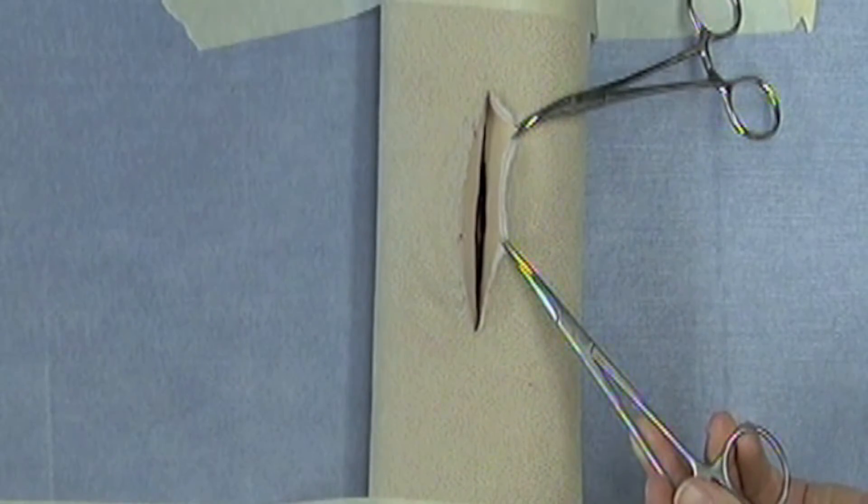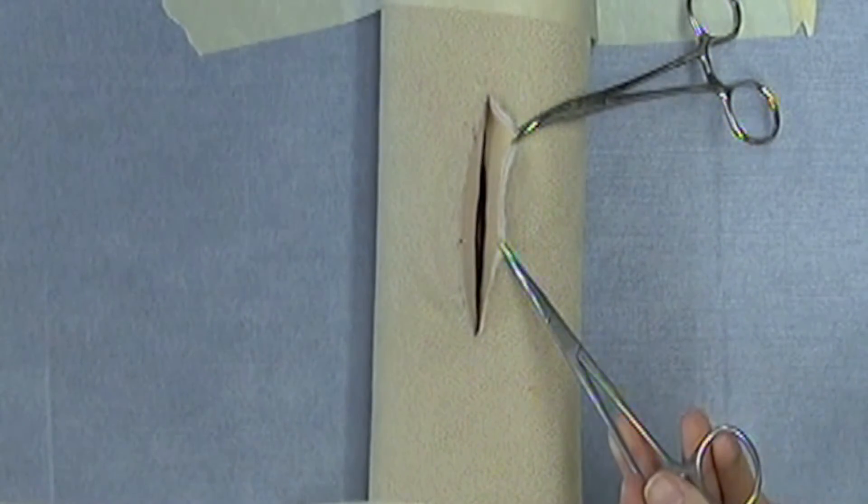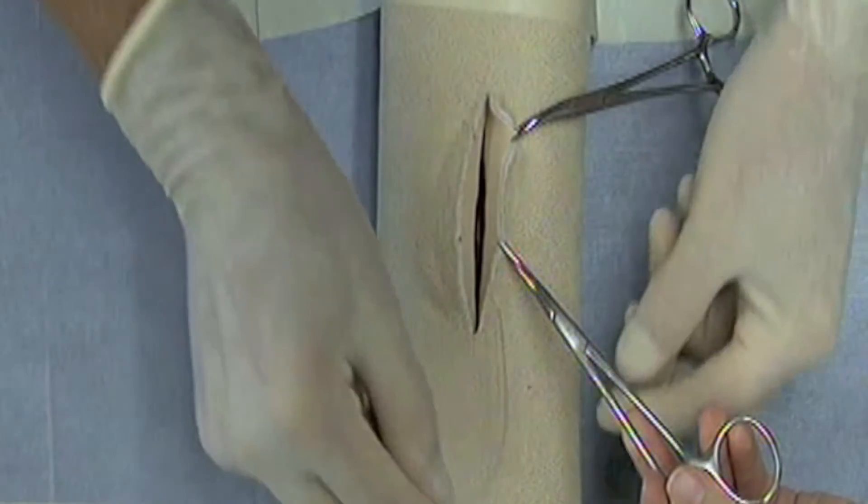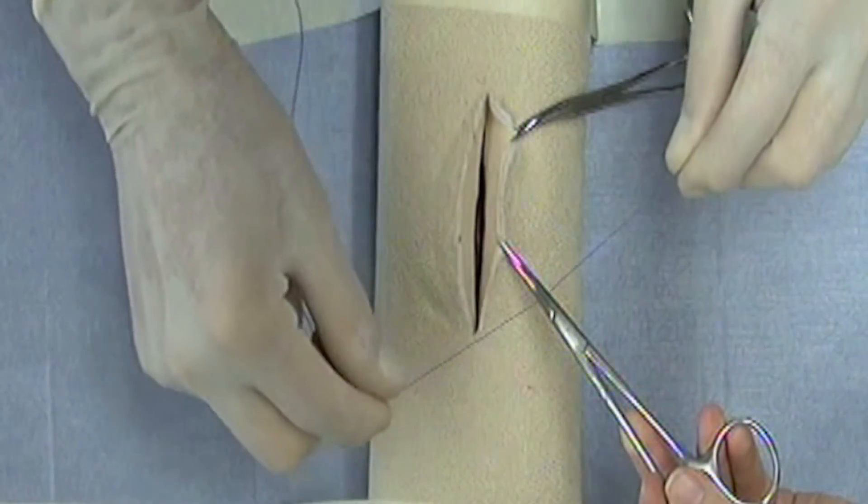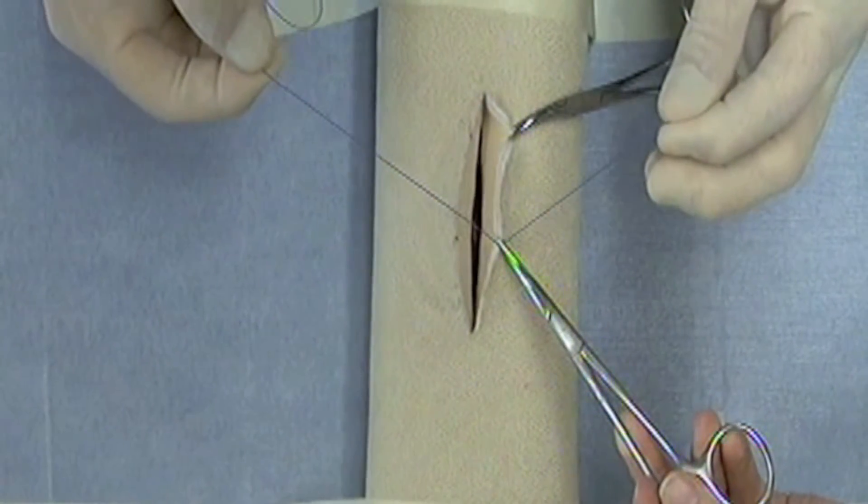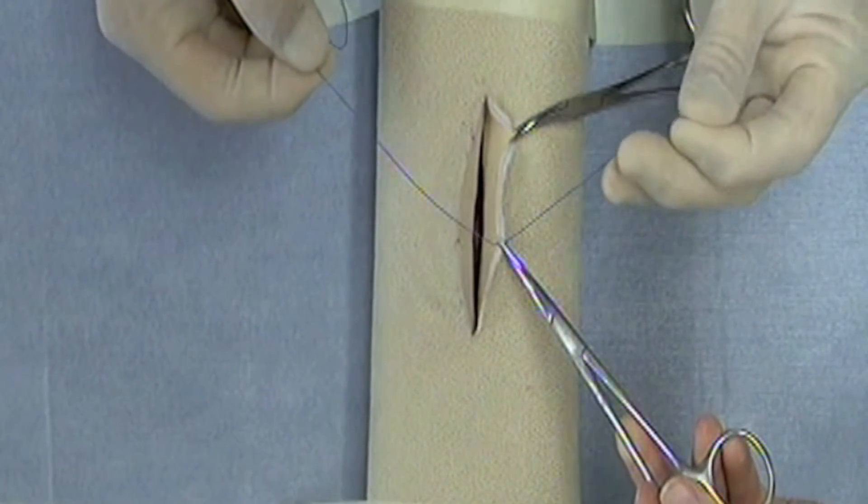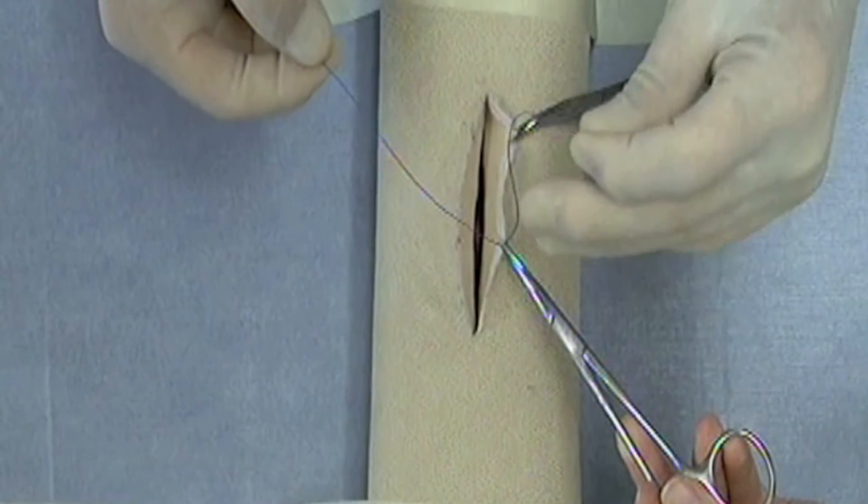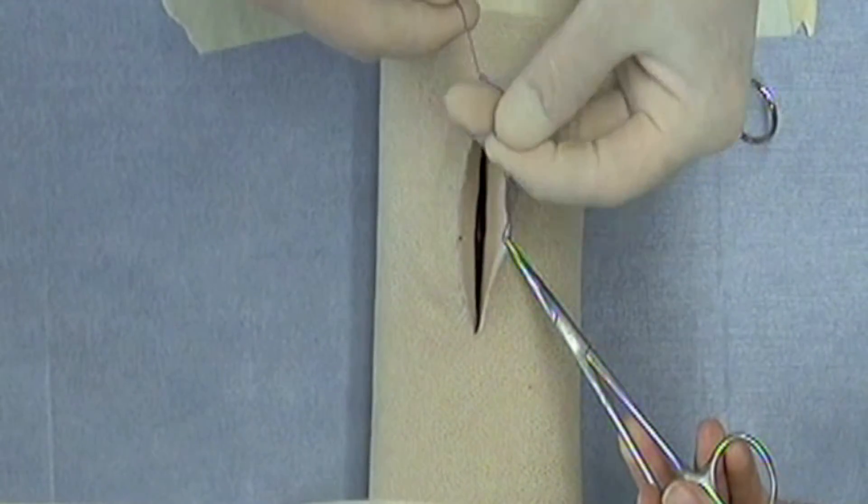Now for this one I will demonstrate a left-handed one-hand tie. Remember as with any one-hand tie, the short end of the suture is in the hand that's doing the tying and so you'll notice that I'm going to complete two throws.